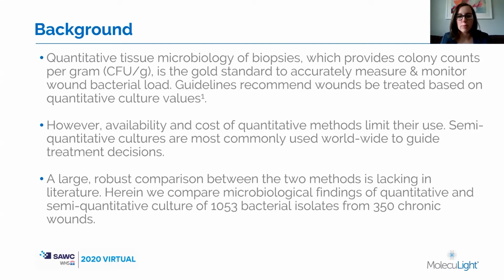However, availability and cost of quantitative methods greatly limit their use, and therefore semi-quantitative cultures are the most commonly used worldwide to guide wound treatment decisions, as well as standard of care assessment with clinical signs and symptoms at the bedside. A large, robust comparison between these two methods, quantitative and semi-quantitative, is lacking in the literature.